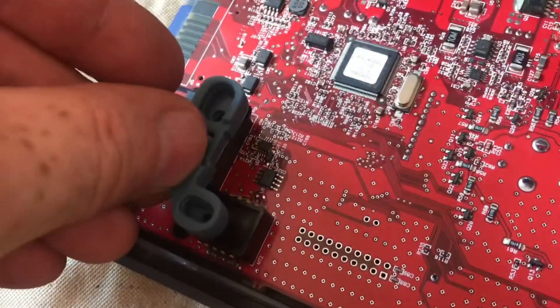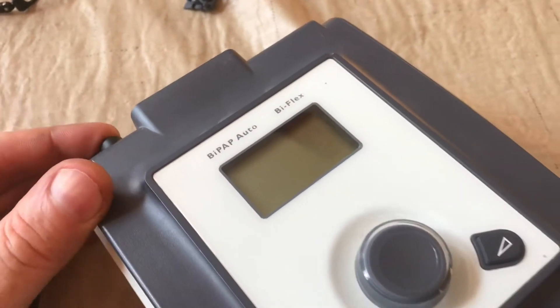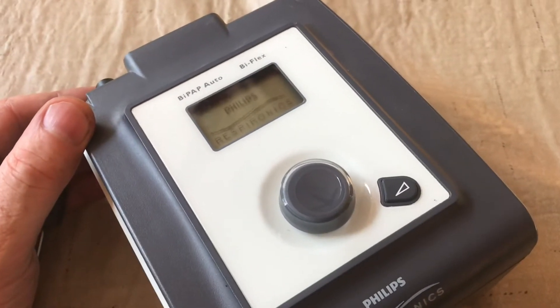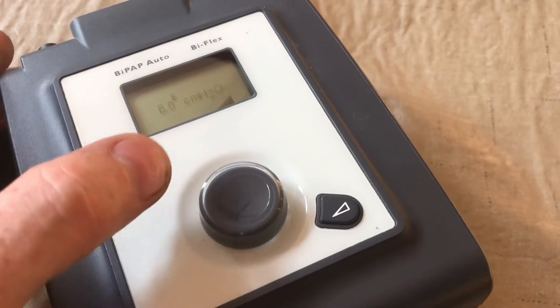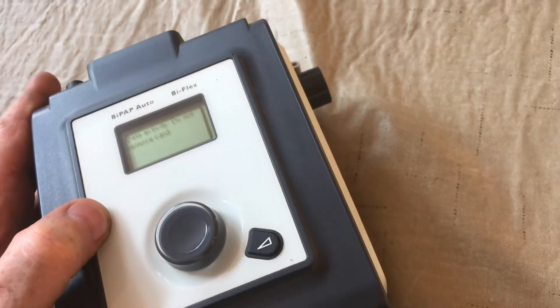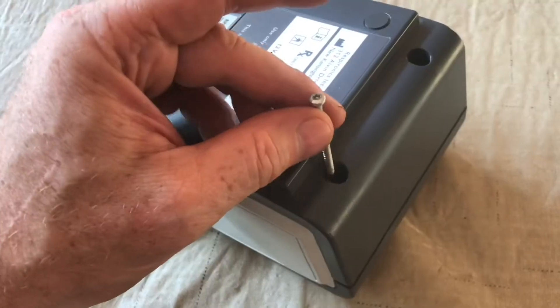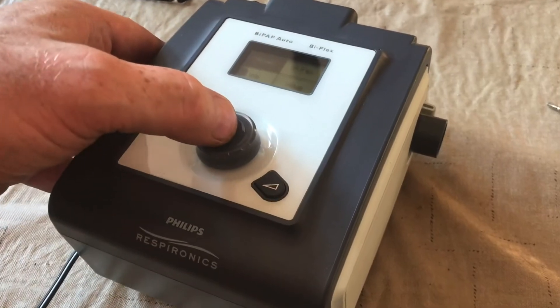We'll place everything back together. With everything plugged in, you'll see the error goes away and it'll run just like it used to. We'll let it go through its cycle — it is blowing air like normal. Fixed. We can put the screws back in and tighten everything back up. Now it's all ready for service.